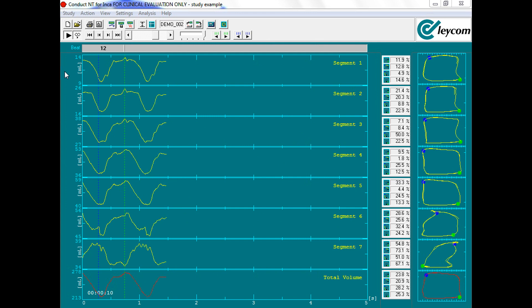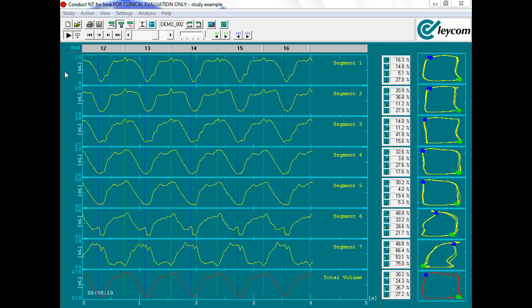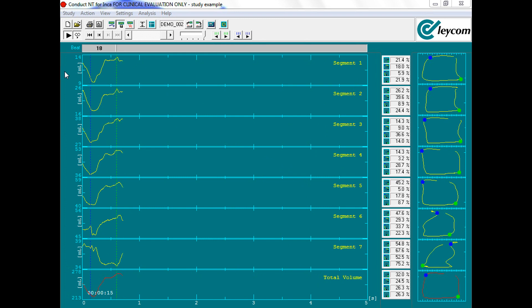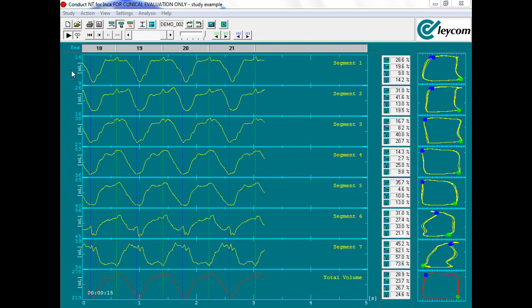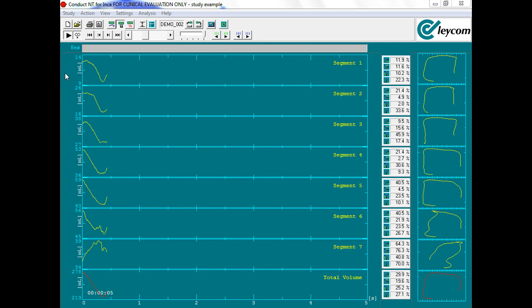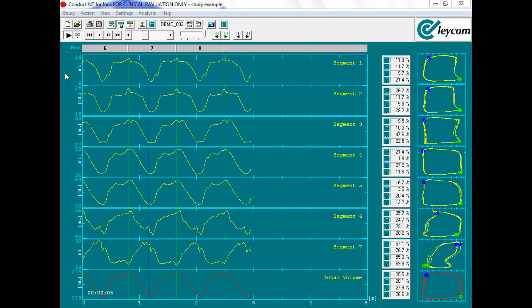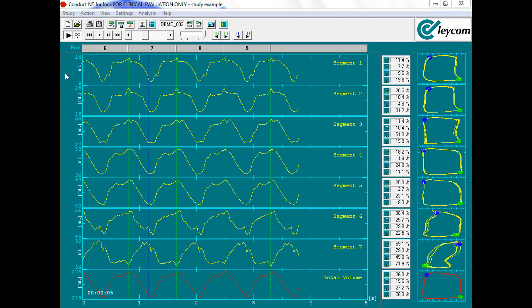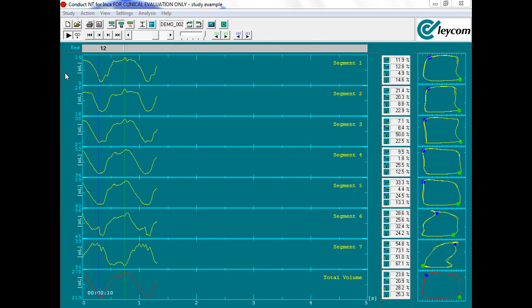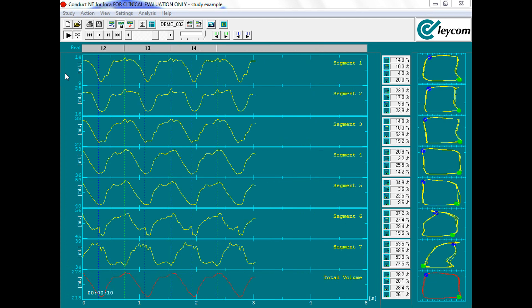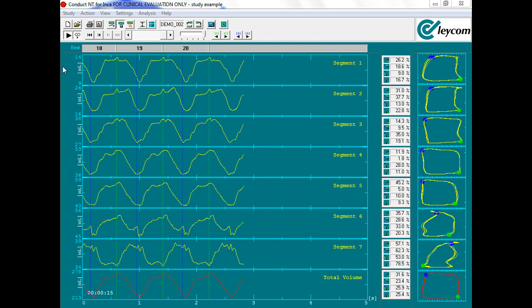That said, CD LACOM does not have a specific recommendation on this number as varying ventricles, ventricle sizes, and geometries will change this minimum value. For the operator, please think of the apex as an anchor for the pigtail as we don't want the PV loop catheter moving during the procedure in order to appropriately compare baseline hemodynamics to that post-intervention.